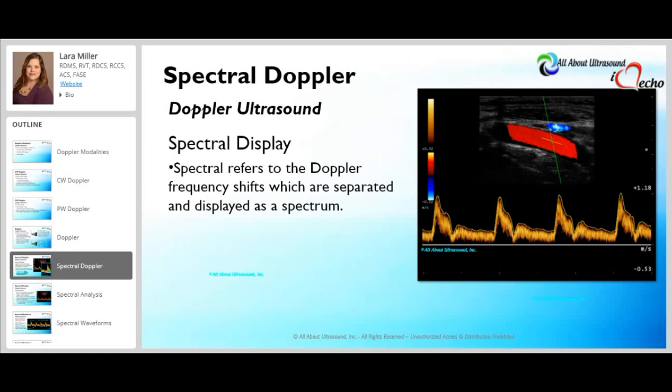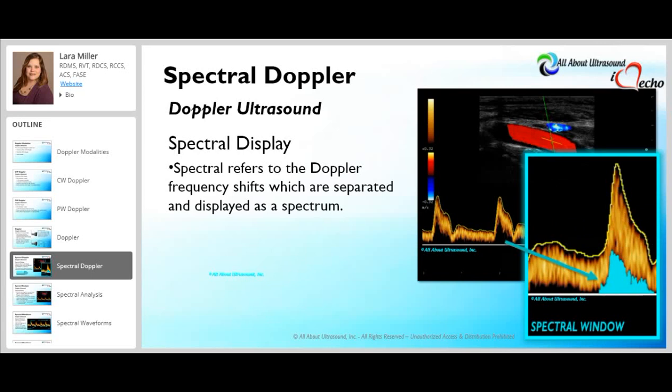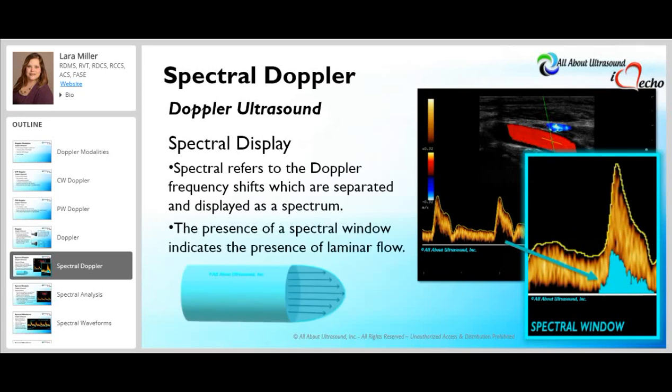A spectral window is the region where there is no signal. The presence of a spectral window indicates laminar flow, which is the normal state of flow where flow streamlines are parallel, aligned, and moving in layers in one direction. With the loss of that spectral window, we call that spectral broadening, which may or may not indicate the presence of turbulence or stenosis.